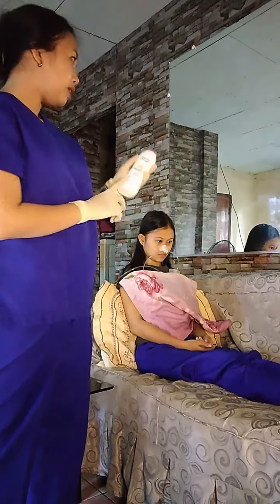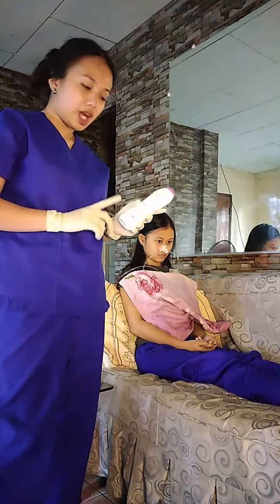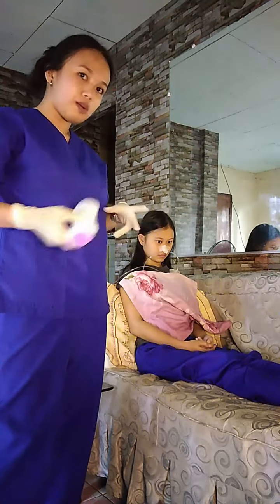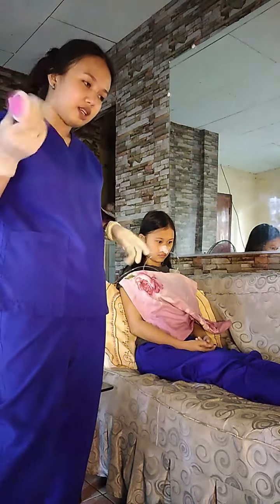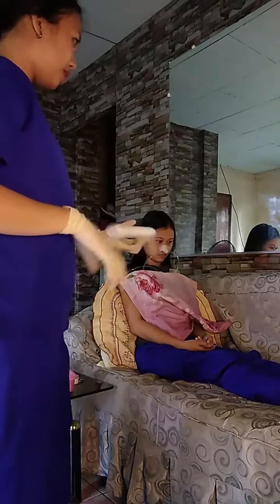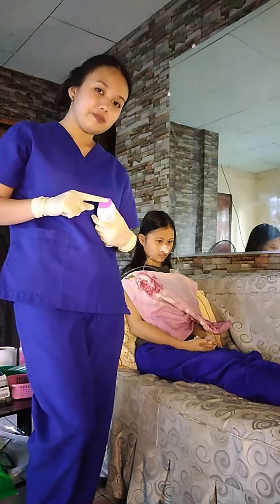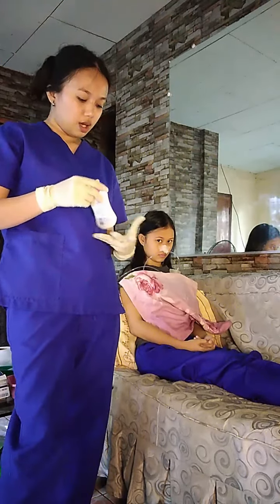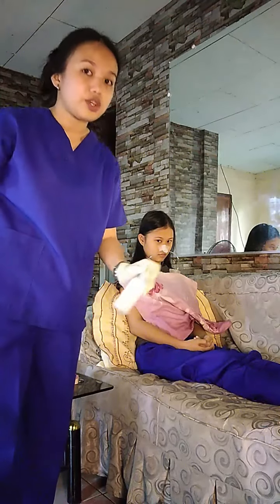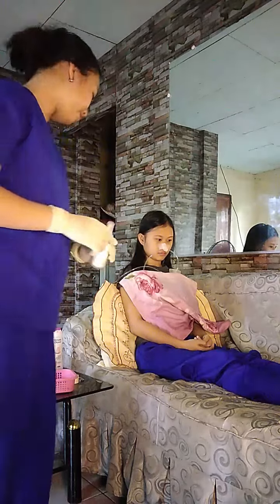I-check ko muna bago ko i-administer, i-check ko muna yung expiration date, and then I will be shaking it well para walang mga buo-buo yung feeding, and then which will cause blockage doon sa tubing. So ayan, pagkatapos nating ma-shake, assuming na yung order ng doctor is 250 ml, I will also get the sterile water, which is 25 ml.